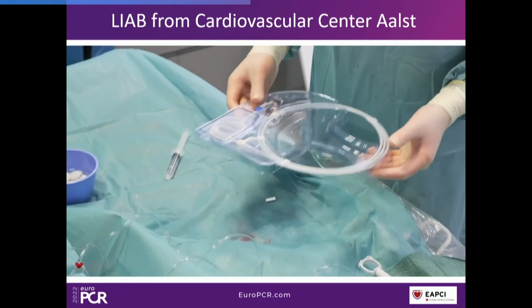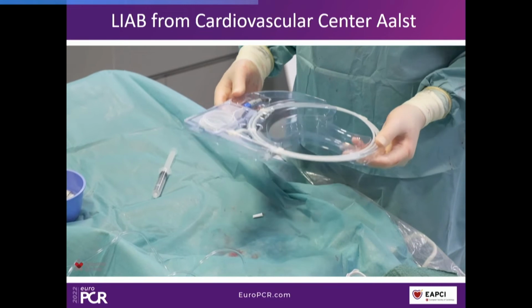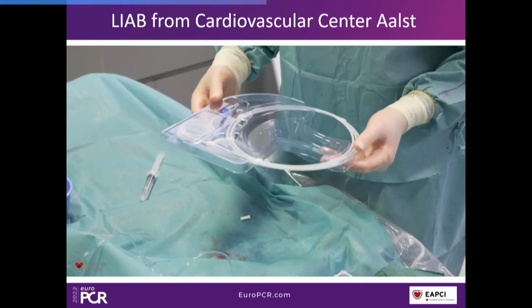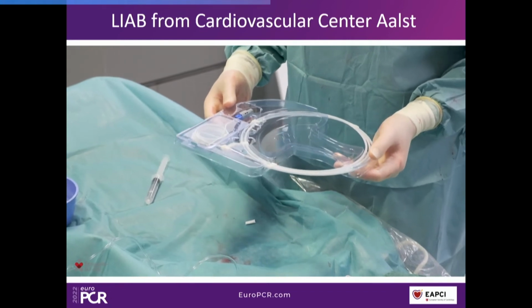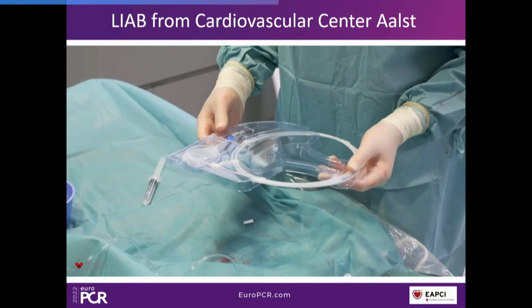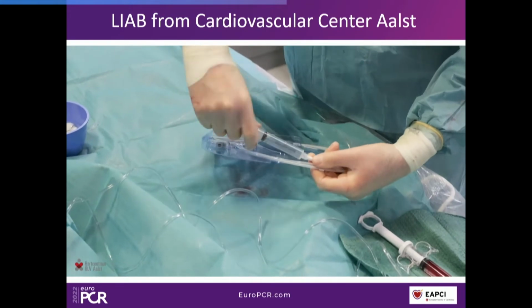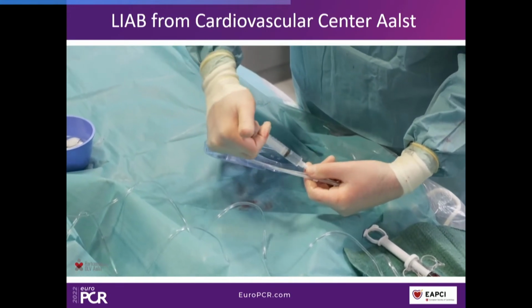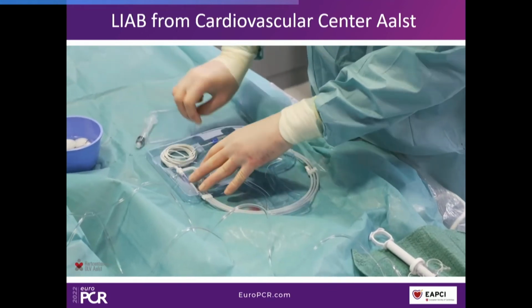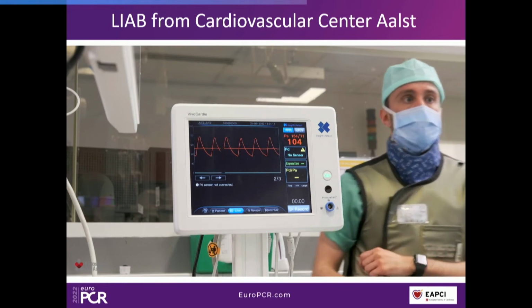Good. Okay, so we'll start with the preparation of the True Physio catheter. This is the over-the-wire rapid exchange catheter that is very useful in multi-vessel evaluation of FFR. And I will show you how we prepare the catheter and how we connect it to the Vivo Cardio station. So we flush the catheter. Once flushed, we will open it and attach it to the Vivo Cardio console.